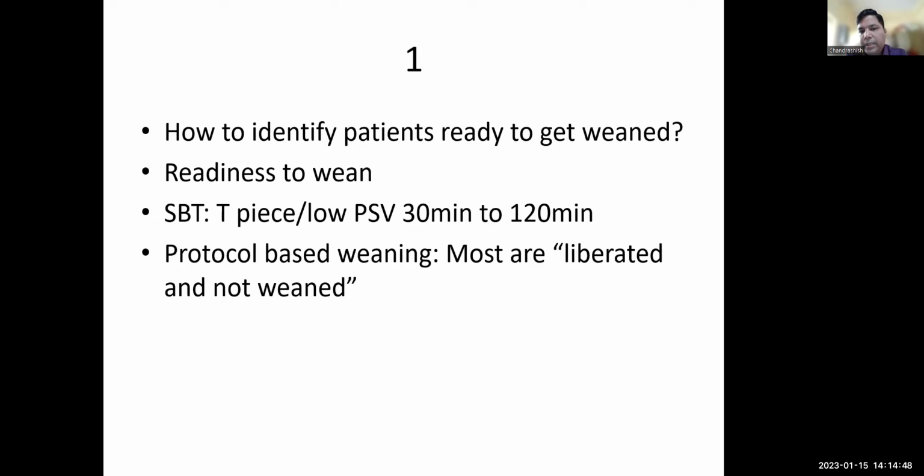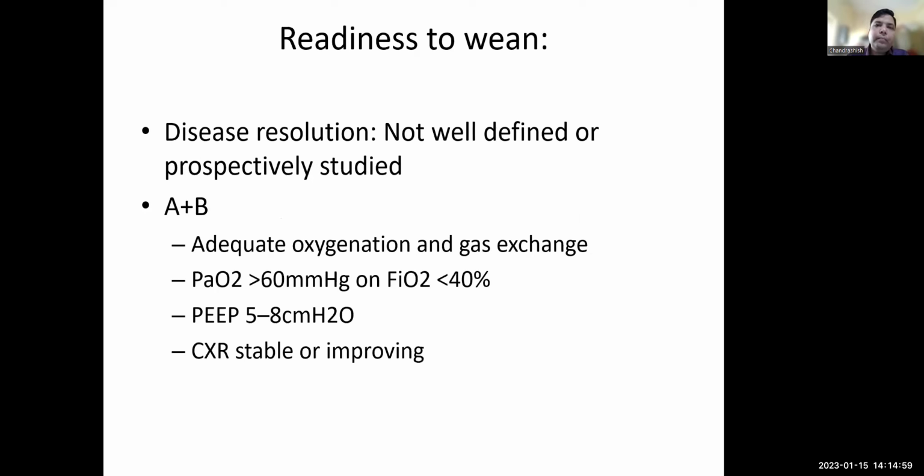Usually pressure support is the most popular mode of weaning, where you slowly reduce pressure support and then take them off the ventilator, although that's not very popular. So how do you assess readiness to wean?